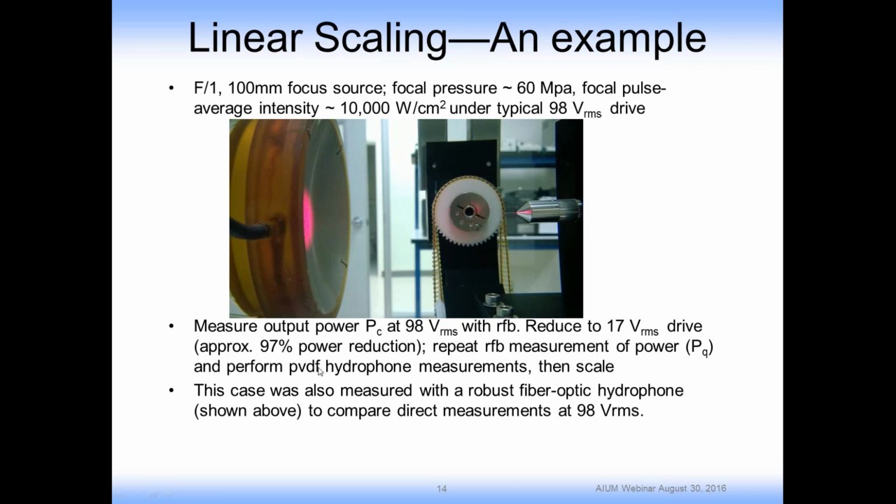And PVDF hydrophone measurements were made with this and then scaled, as we'll discuss. This picture also shows the use of one of these robust hydrophones, in this case a fiber optic hydrophone, so that we could actually compare the scaled measurements to some direct measurements that were performed at 98 volts RMS.